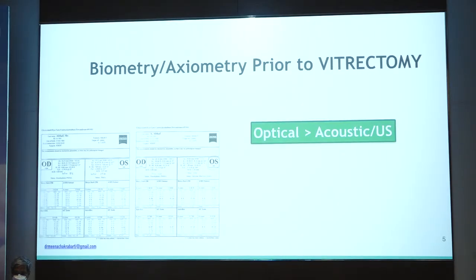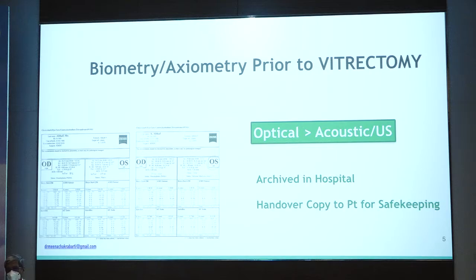The ideal situation would be to have all patients who undergo vitrectomy, with or without silicone oil tamponade, have their biometric recording before performing the posterior segment procedure. The same can be archived in the hospital and a copy given to the patient in case he has to go elsewhere for his cataract extraction.